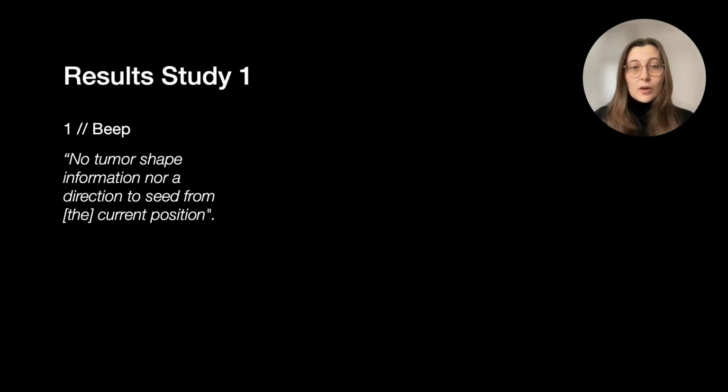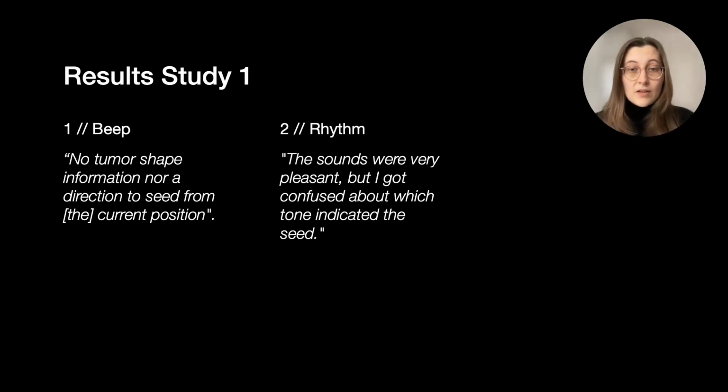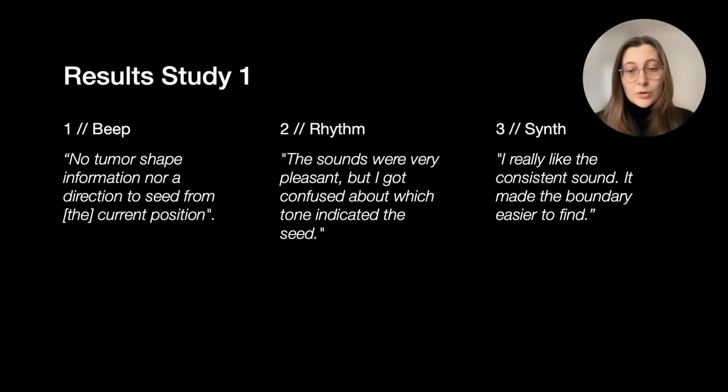We further collected qualitative feedback from the users regarding the three sonifications. They said that beep was easy to understand, but it does not provide tumor shape information, nor does it indicate a direction to the seed from the current location. One participant said about rhythm that the sounds were very pleasant, but I got confused about which tone indicated the seed. Synth was ranked as a preferred sonification by 75% of the participants. One person explained, "I really like the consistent sound, it made the boundary easier to find."